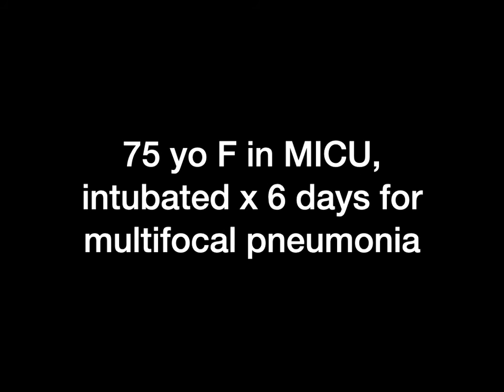So before we conclude our talk about hepatobiliary ultrasound, let's go over a few cases to help apply and stretch your new knowledge. Our first case is a 75-year-old female in the MICU. She's been intubated for the last 6 days for a multifocal pneumonia. On hospital day 6, she is noted to have an increasing white count, tachycardia, and fever.